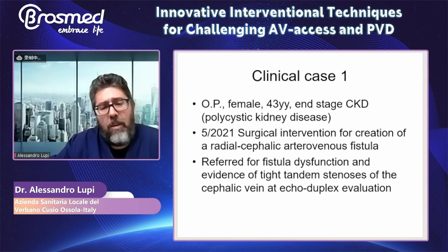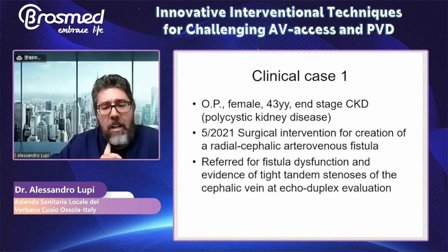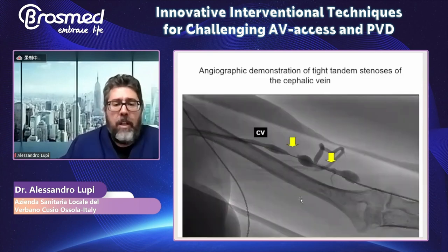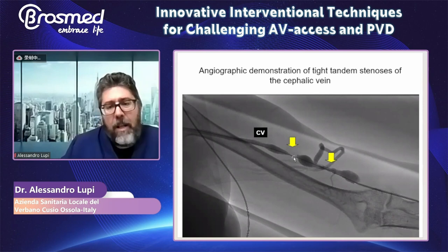In 2021 a radiocephalic arteriovenous fistula was created for dialysis treatment. The lady was referred for fistula dysfunction and evidence of a tight tandem stenosis of the cephalic vein at echographic evaluation. I'm sorry that I cannot enlarge the image, but you can see that here there is a very tight stenosis. Here is a lesser but longer stenosis.